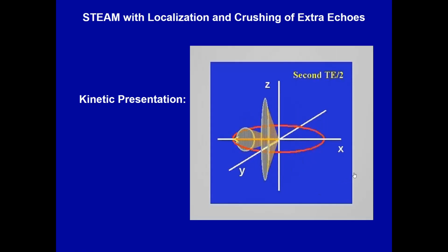We have net magnetization in the XY plane. We will detect what's projected onto the XY plane. But because there is the remnants of this previous dephasing, we only observe 50% of the magnetization we would have gotten, say, with a spin echo. But the fact that we can do 3D localization, and that the localization can be done with very sharp volume, sharp distinction on the voxels, often it's worth the sacrifice of 50%.